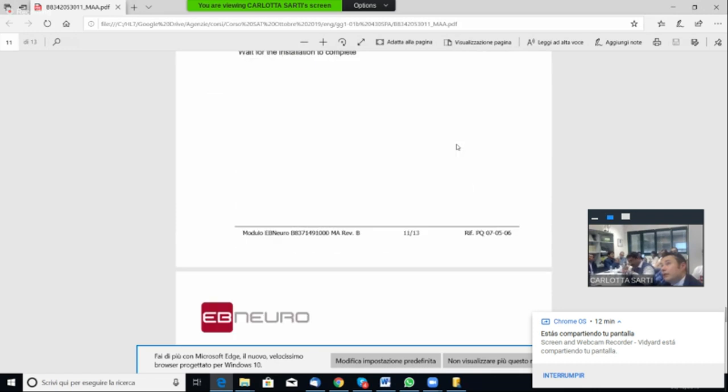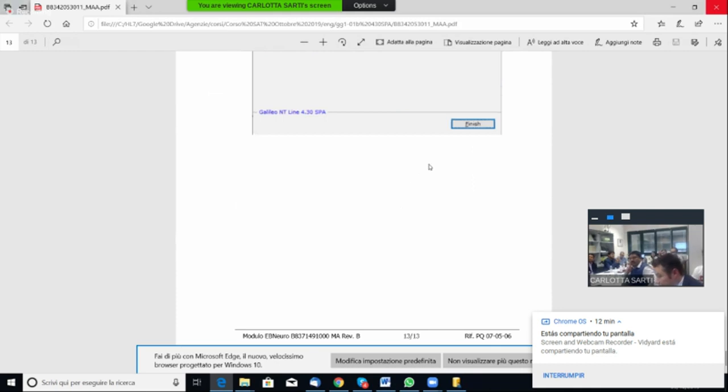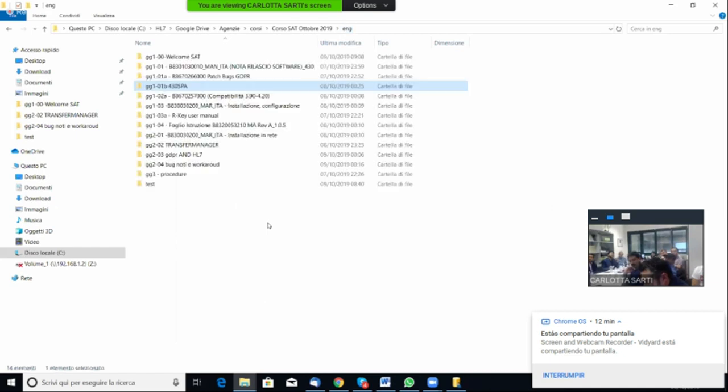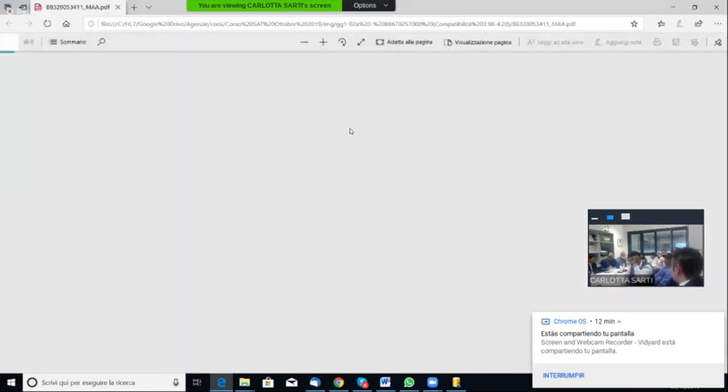Okay. So now we will finish the first part about the release note, and I showed you that we have the Galileo line, the good installation, the patch, and the service pack A. So I repeat that we also have the service pack A, or also the patch compatibility about the 3.9 version of Galileo.